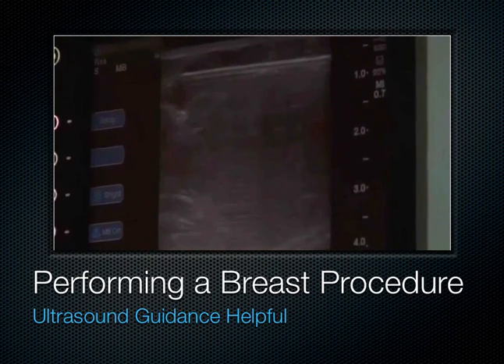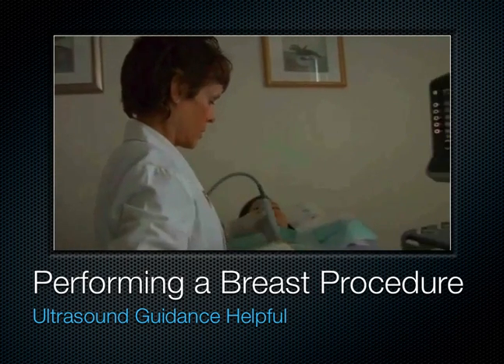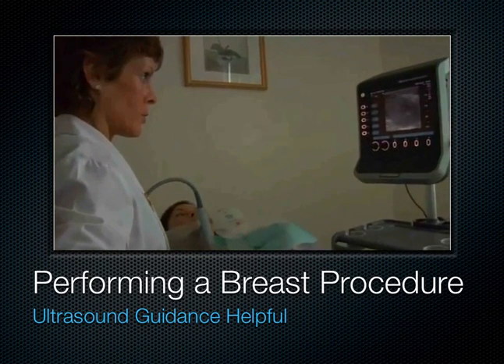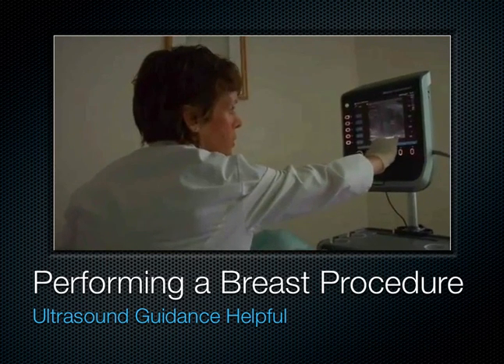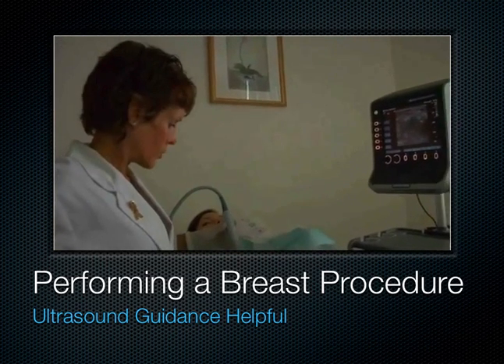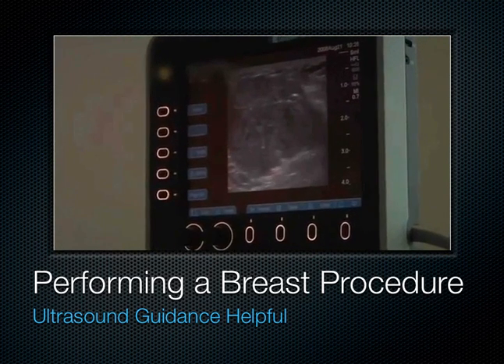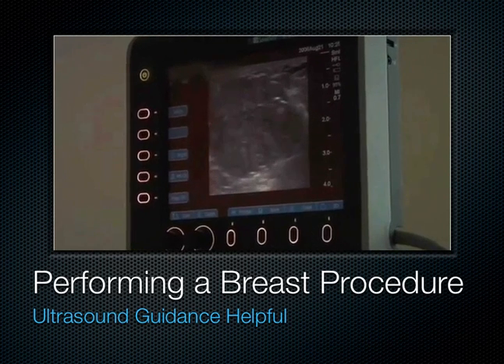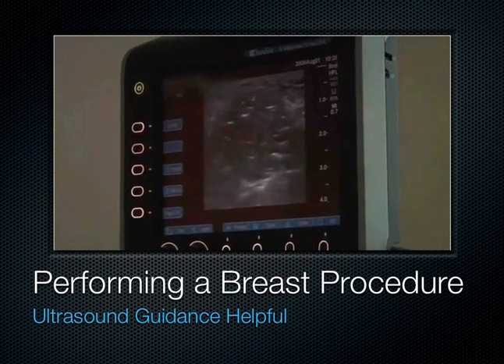And then the last thing I'm going to do is put some numbing underneath it, because it's not only close to the skin, but this line down here is her pectoralis muscle underneath. So sometimes as that ice freezes, it gets real cold on the pec. So I'll put some numbing down, kind of get it below. So you probably will feel this a little bit more.